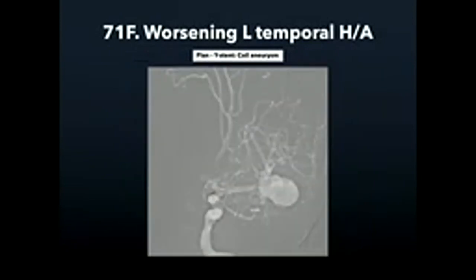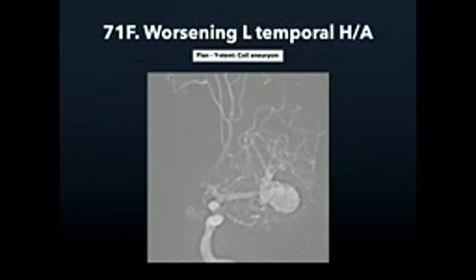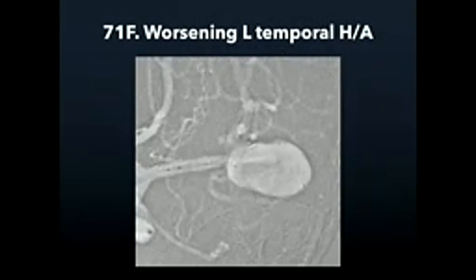And just to show you the access, it was really pretty straightforward. The whole procedure took about 40 minutes. So there's the access into that M2 out there. I'm not sure how well this projects. It's usually pretty visible. You can see the Silk Vista here, part deployed, and you can just see it wasting a bit as it comes through the Atlas about there. So the Silk Vista is just coming out there.